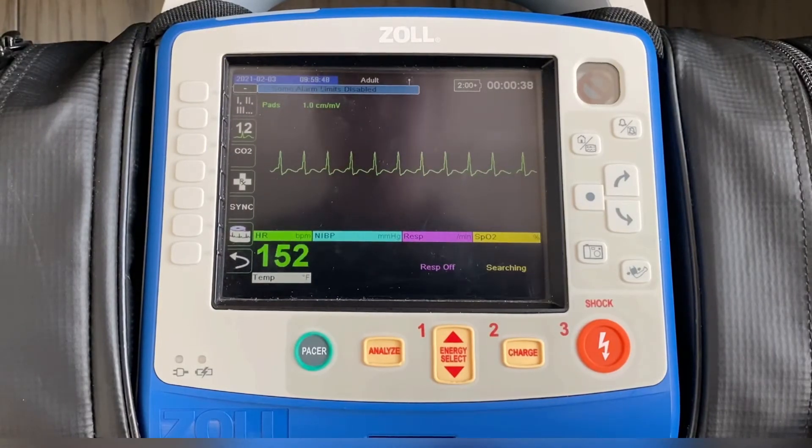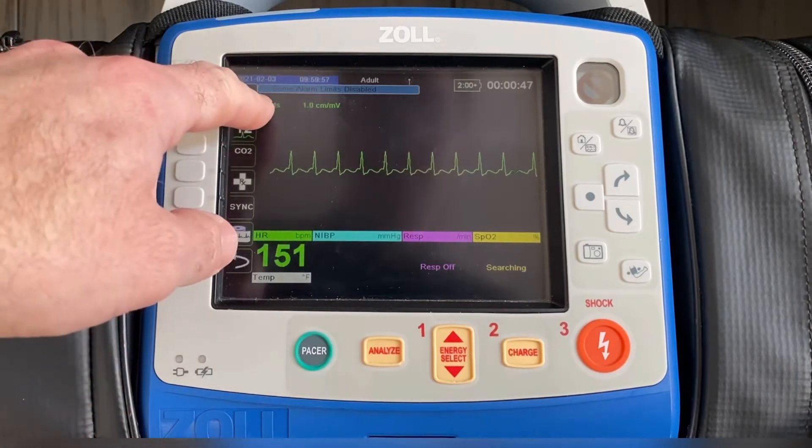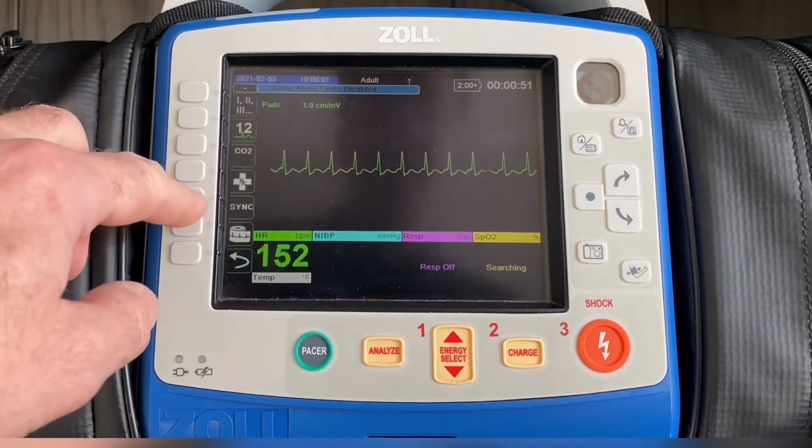To successfully cardiovert on the Zoll X-Series, the key button that we want to make sure you're aware of is the sync button on the left-hand side of the monitor. First, check to see if the device is in pads mode and you're picking up a rhythm through the pads. Then press sync.